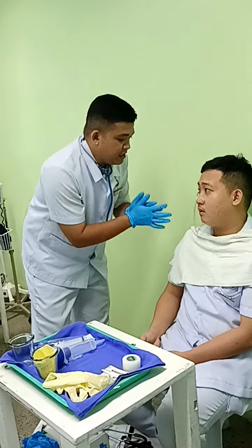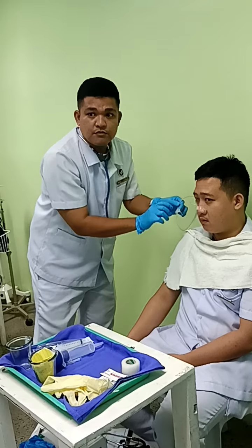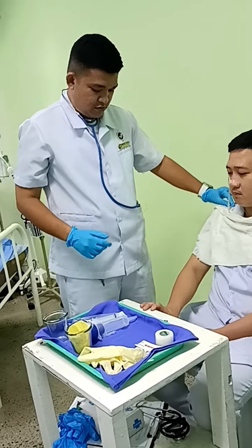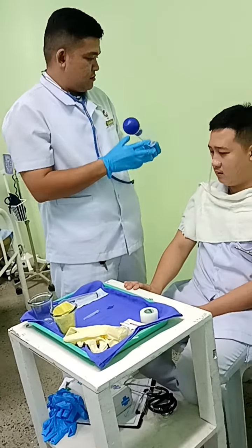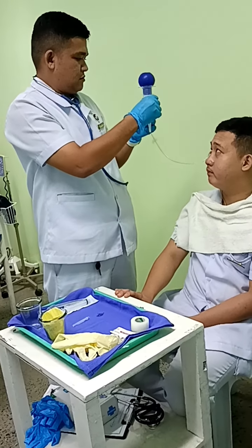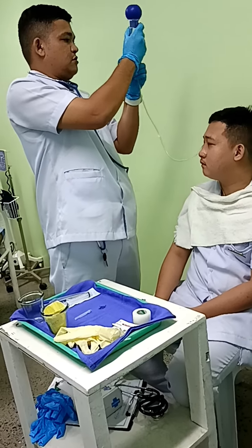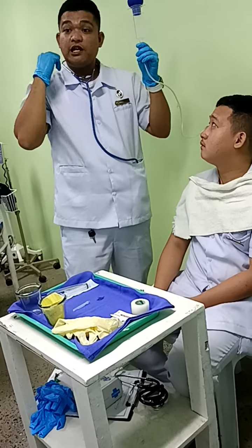So check the tube placement, check for any residues. If there is any residue present, we have to irrigate it with water.